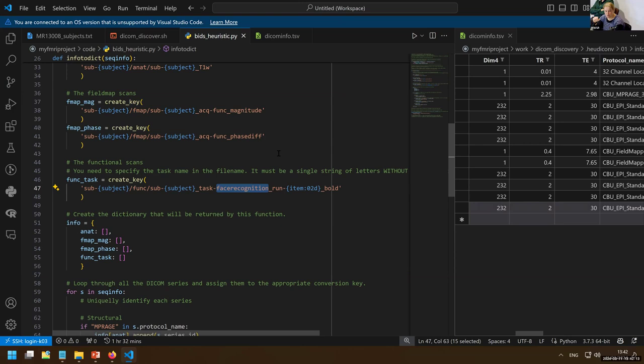Underscore links key-value pairs, and hyphens link the key to the value. So it needs to be a single string, but I can use so-called camel casing, and I can't use an underscore or hyphen here.